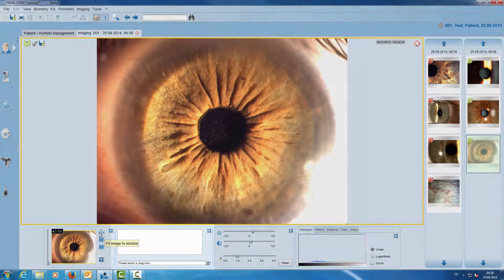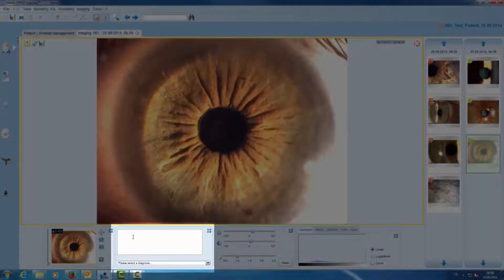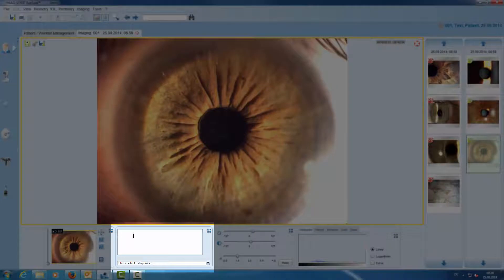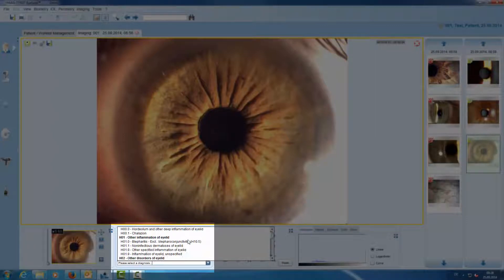The next tool is our note tool. In the white space we can write any comment, or we can select from the ICD list.